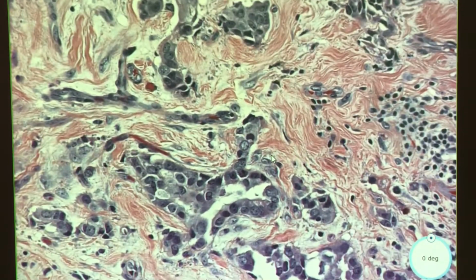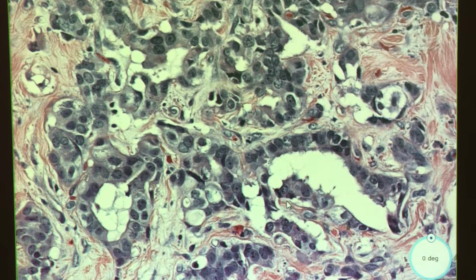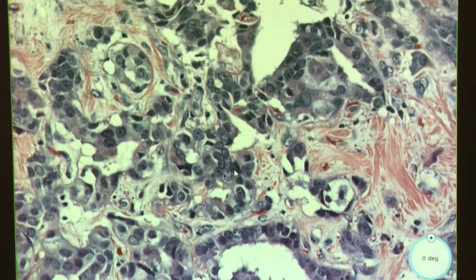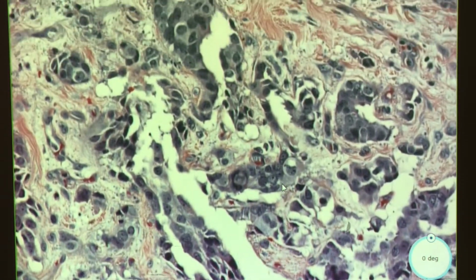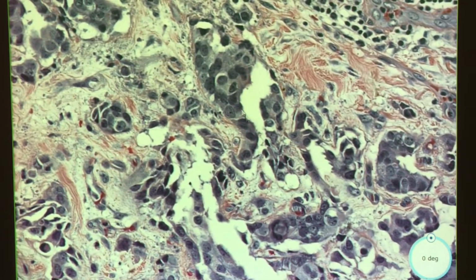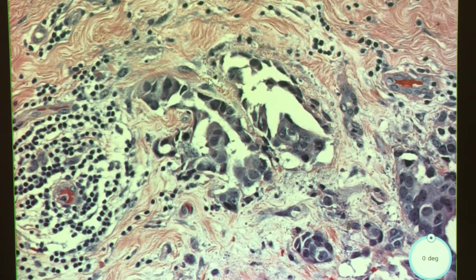And then, it's a good thing I have notes. Let's see if we can find some good mitotic figures. Maybe there. Hard to say. That looks like one. Okay, one's keeping a ticker going. And with these, sometimes you can spend a good while trying to find mitotic figures.